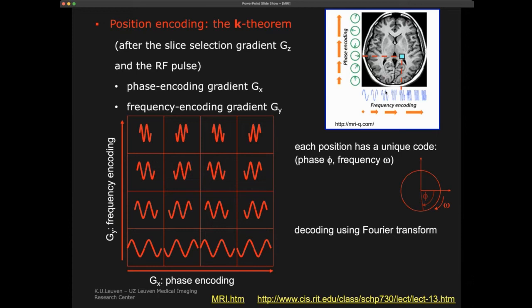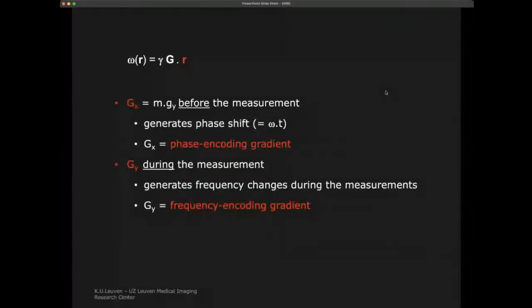So what we do with magnetic resonance imaging is we actually measure the Fourier space, which they call K space in here. And then doing a simple inverse Fourier transform, we actually get our images. So reconstruction by MRI is based on inverse Fourier transform, the simple type of reconstruction, where we use the simple phase and frequency encoding.